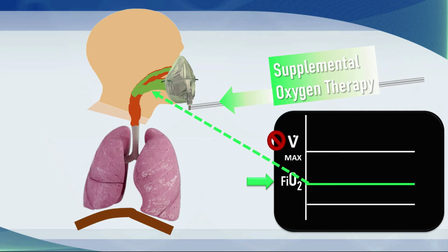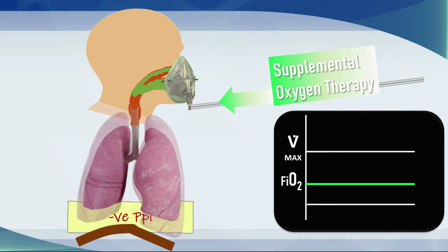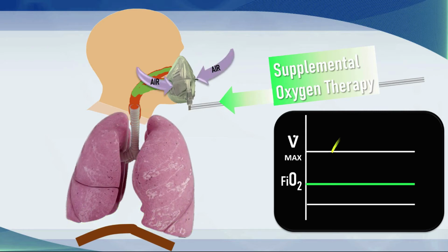When the patient initiates a breath and oxygen-enriched air enters the major airways, it does so having derived air from the fresh gas flow, from the mask, from the nasopharynx, and from the air outside. And this all gets blended in. And the purpose of dialing up a specific flow is to ensure that everything gets blended into the right mixture so that when the gas goes into the trachea and down the bronchi and down to the alveoli, the patient gets the FiO2 that you're looking for.